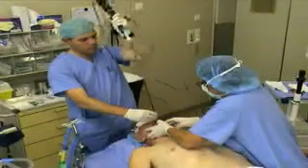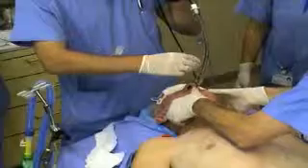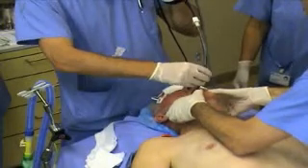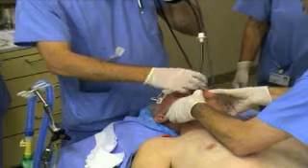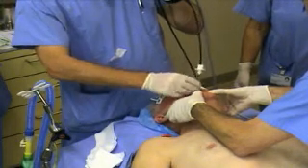Insert the fibroscope at the midline and follow the posterior wall of the oral airway. The end of the epiglottis can be easily recognized as you proceed. Advance the fibroscope through the glottis just above the carina as demonstrated previously. When the insertion of the fibroscope has been completed, remove the slit oral airway and advance the flexible tube using rotating movements while maintaining the chin lift and jaw thrust maneuver.